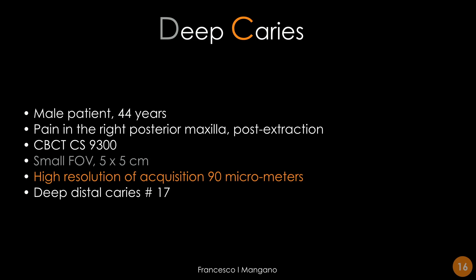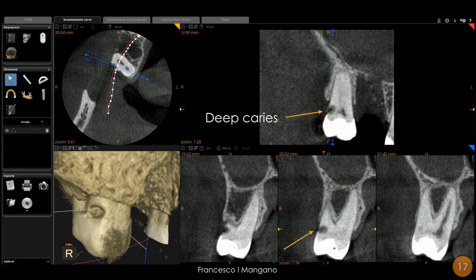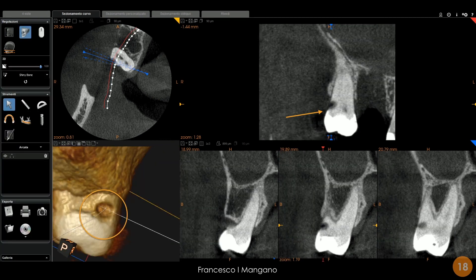Particularly if we don't have scattering from metal artifacts, we can also see deep caries with this kind of high resolution of acquisition, with this small field of view and the same machine. If we reconstruct the volume with volume rendering in the software, we can see that we are capable of discriminating very small structures — like caries — in different reconstructions and very clearly.